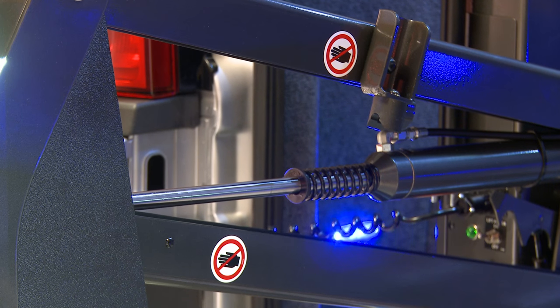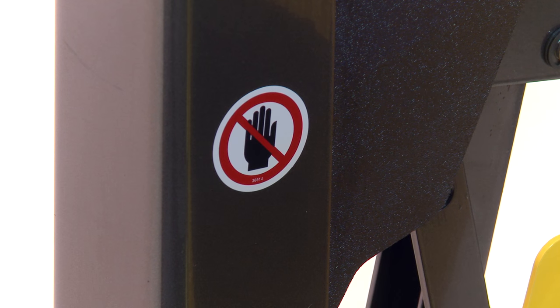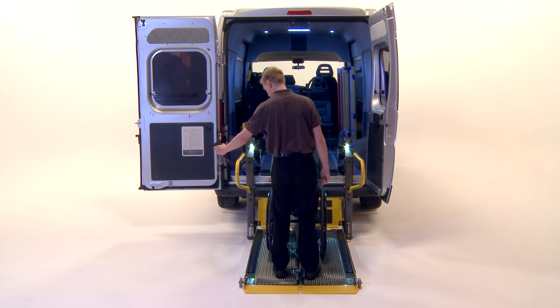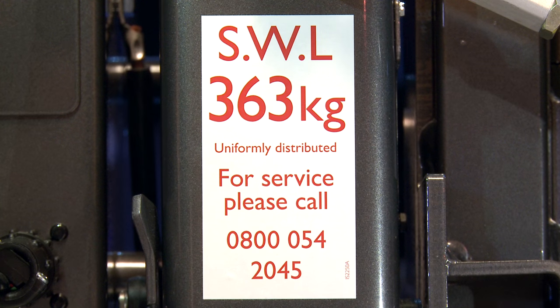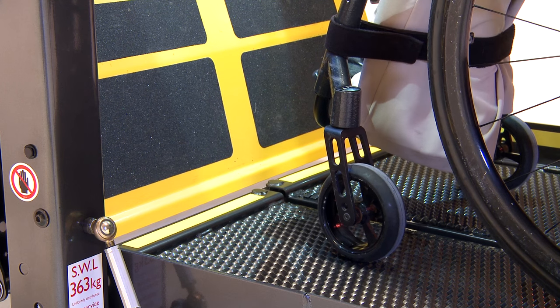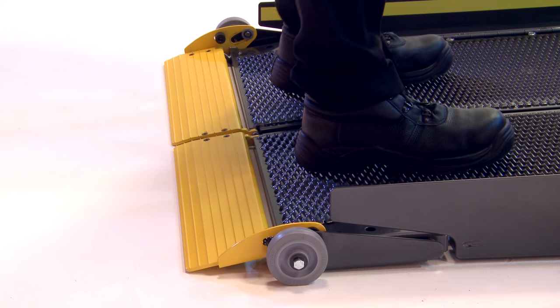Before operating the lift, ensure that all persons and or equipment are clear from the operating platform mechanism. Ensure no persons or equipment are overhanging the platform. The combined weight of the wheelchair, its occupants and the attendant must be below the lift safe workload, indicated on the sticker. Ensure the wheelchair and attendant are not obstructing the lift inner and outer barrier.